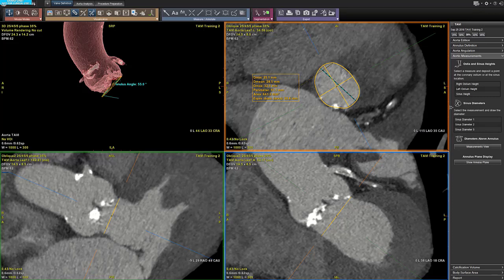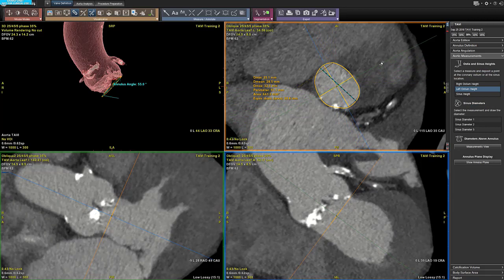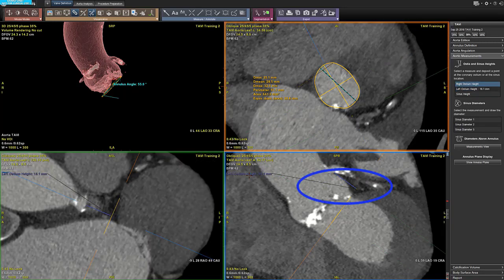The ostia and sinus height are calculated by a semi-automatic measurement. You can select the measurement in the wizard panel. Then you look for the coronary ostium in the views. Once you have found it, you deposit one point at the coronary ostium. The perpendicular measurement to the annulus plane is drawn automatically.